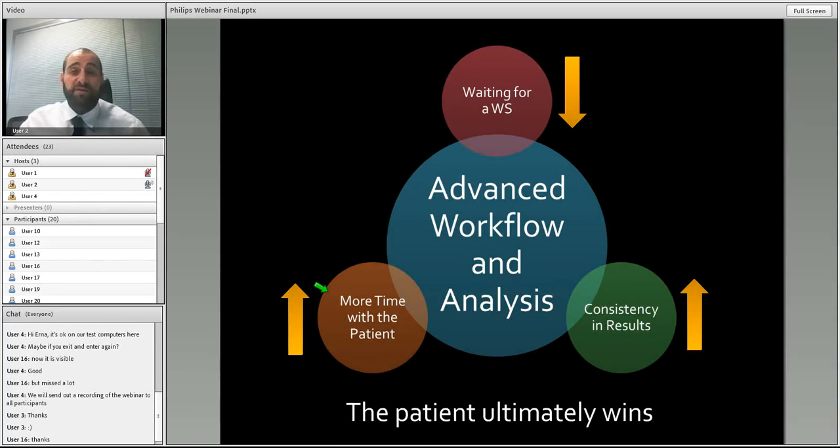I have access to all the information as a one-stop shop. Patients don't have to wait longer because the neuroradiologist is away on holiday and the other guys are not confident in reporting it. I could even be in Hawaii having a mojito and log in and have a look at this patient really quickly, just to give a second opinion. Or I can go to the United States, or to Europe, Paris, Italy, Belgium, anywhere I want, to any of my friends, and ask, can I please have a second opinion? It is instantaneous, and they have full access.